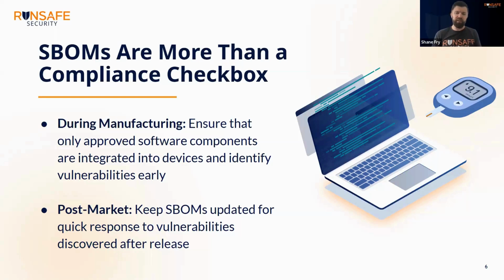If there's a vulnerability in glibc or the Bluetooth daemon or some other communication protocol that's used in a medical device, we shouldn't ship it. We should treat that just as if it were proprietary code that we wrote. So that's a big piece in kind of the during manufacturing side of things.